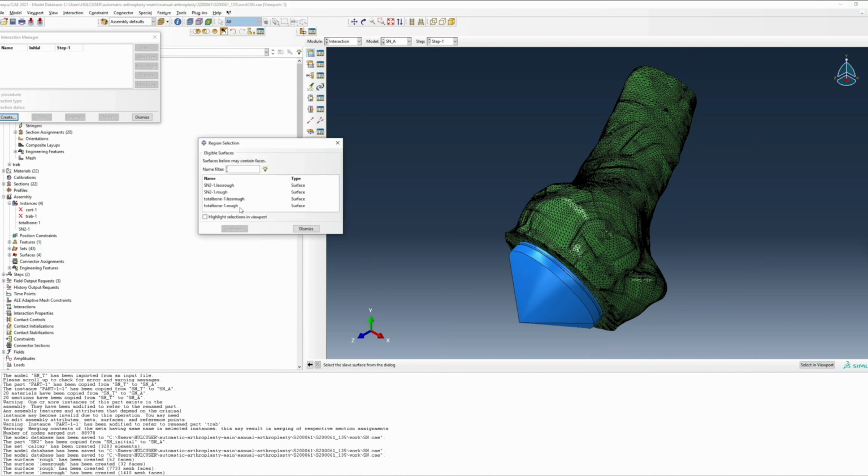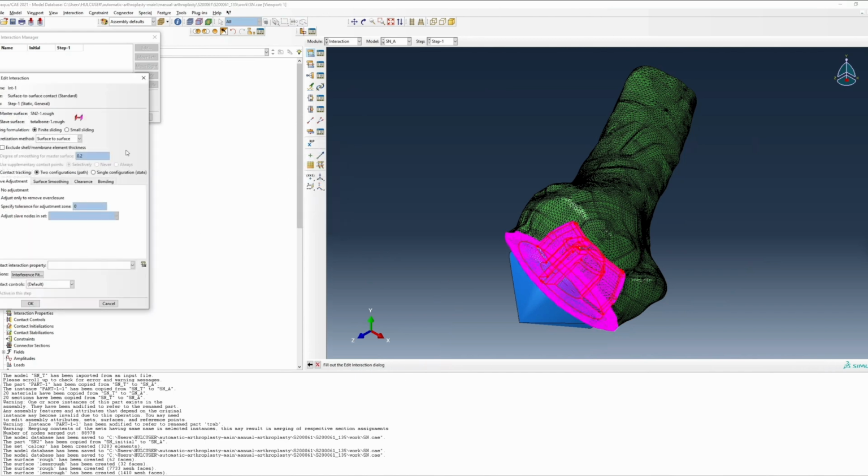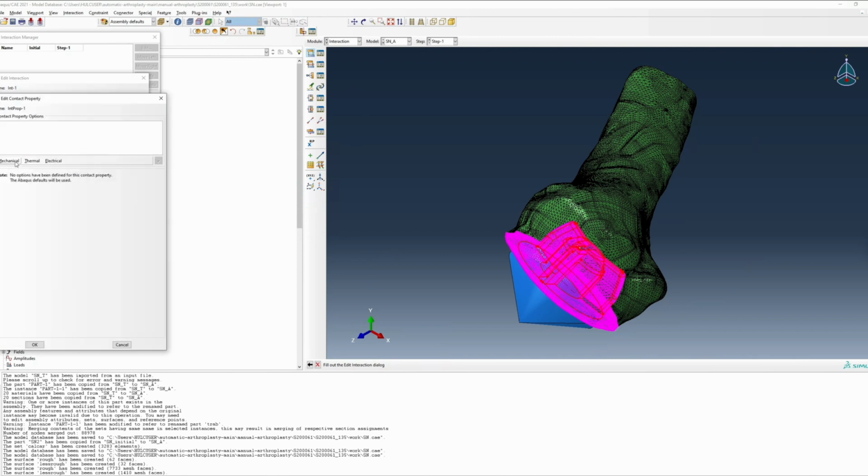Now that we have our surfaces created, we can begin by assigning interaction properties through the Interaction Manager. Here, I'm assigning a finite sliding surface-to-surface interaction to my implant. I'm adjusting to remove overclosure and creating a new interaction property with penalty tangential behavior and hard contact normal behavior.